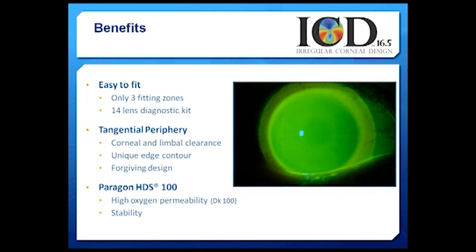A unique design characteristic of the ICD is it was designed with tangents in the periphery. Why tangent surfaces? Tangents because the eye surface is tangent. It's a straight line, flat tangent shape. So therefore the ICD was developed using a number of tangents in the periphery to best vault and align through the peripheral cornea, limbus, and then create the landing on the sclera that's optimal.